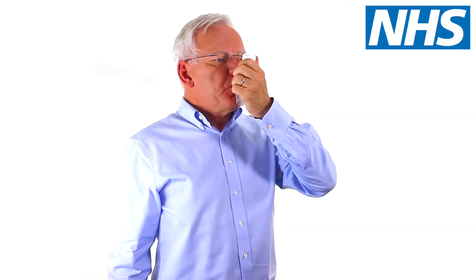Breathe in through your mouth as deeply and as hard as you can to make sure you inhale the full dose of medication.